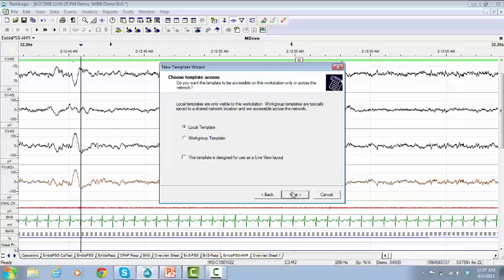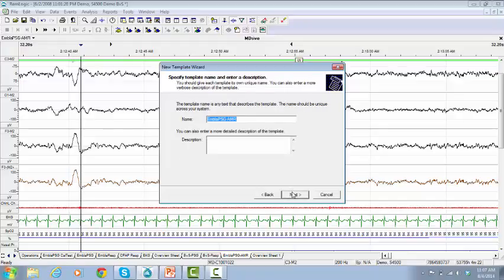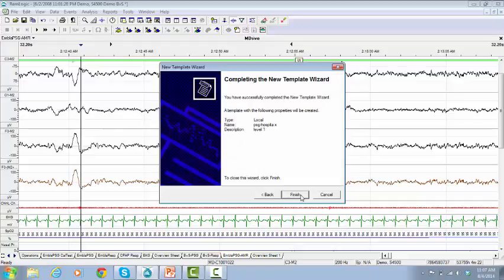Click Next. Give a name for your new template. Add a description to differentiate it from other templates. Click Next, and click Finish.